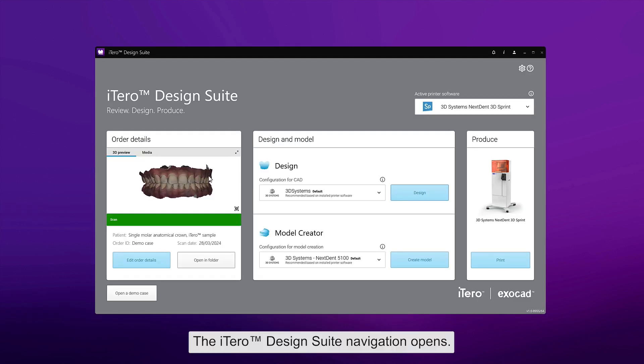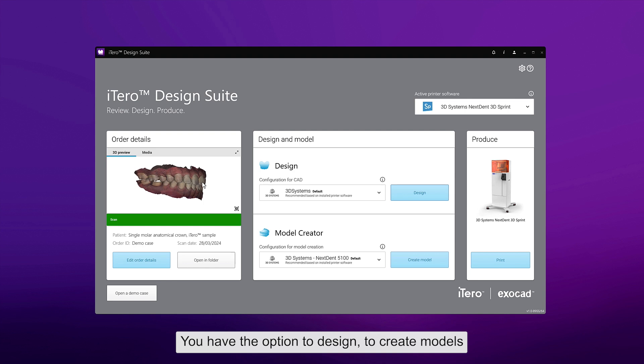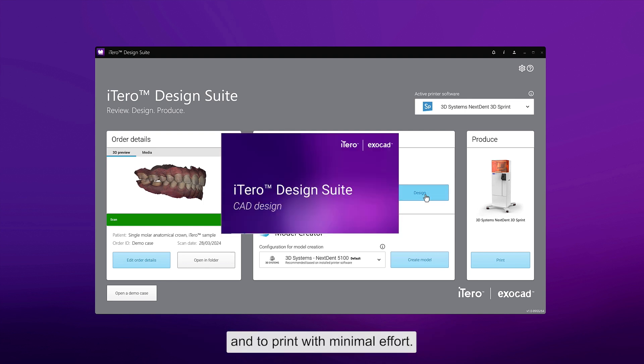The iTero Design Suite navigation opens. You have the option to design, to create models, and to print with minimal effort.